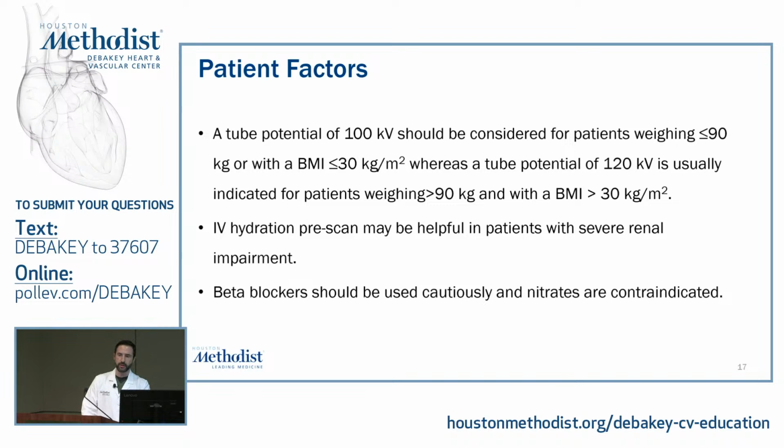One way to minimize radiation during the retrospective scan of the heart is we can do tube modulation. So you can lower the tube kV during systole. That's where most of the motion happens in the coronaries. And then you can go back up in diastole. So you can do some tube modulation. That can lower your radiation dose by about 30–50%.